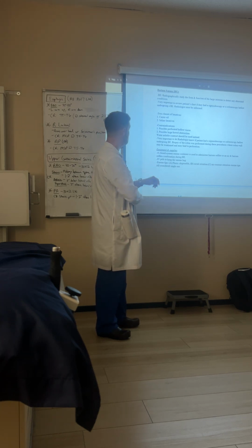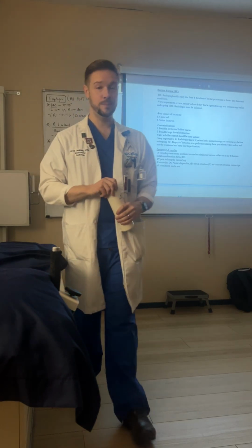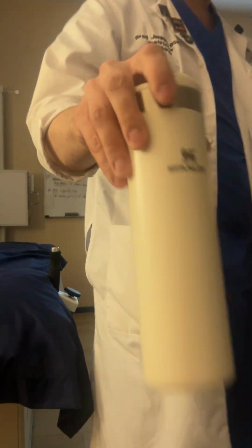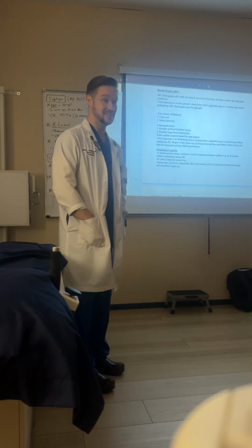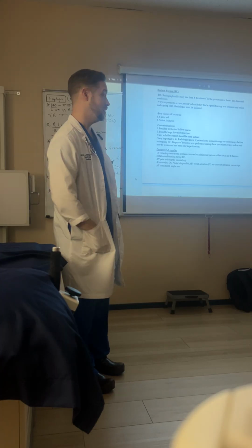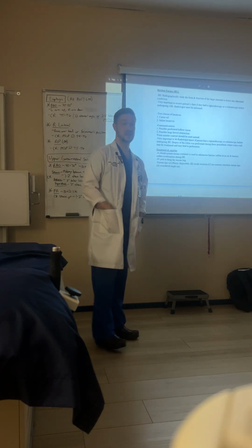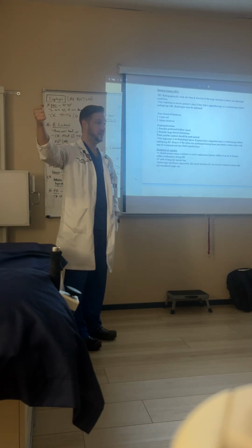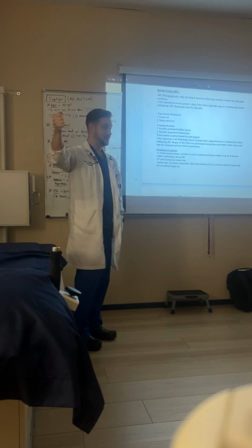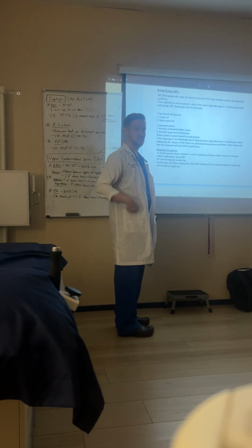There are two classes of laxatives that are used to help patients get prepared for a BE. If you ever talk to a patient who has had a barium enema, they will tell you how intense the prep is for a barium enema. It is laxatives, it is enemas, cleansing enemas. They have to drink a whole gallon of laxative to clear their bowel so that we can get a very clean large intestine for their study.